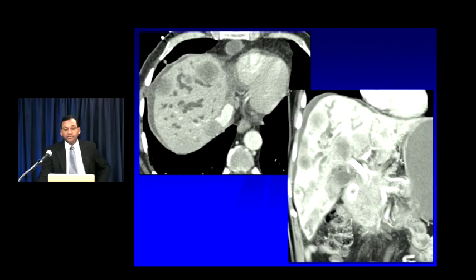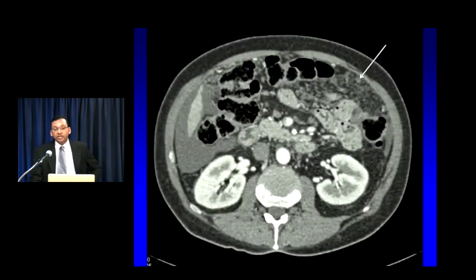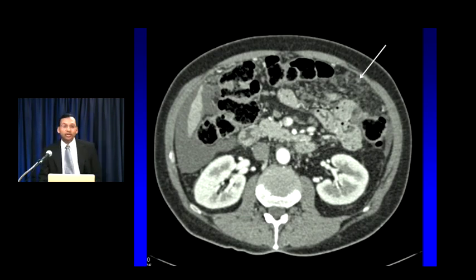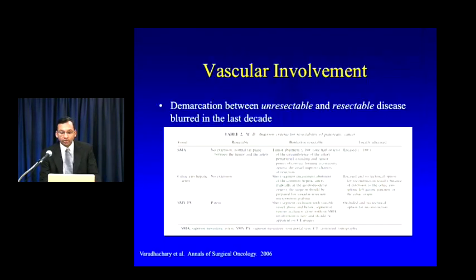Here's a patient with a big pancreatic cancer in the pancreatic head and multiple hypodense metastases throughout the liver — clearly unresectable. As mentioned, carcinomatosis can be quite difficult. Any time you see ascites in a patient with pancreatic cancer, spend extra time looking at the omentum in the mesentery. Ascites is your number one clue that something is going on in the peritoneum. Look carefully for any stippling, nodularity, or unexplained stranding or induration in the omentum that could reflect underlying adenocarcinoma.